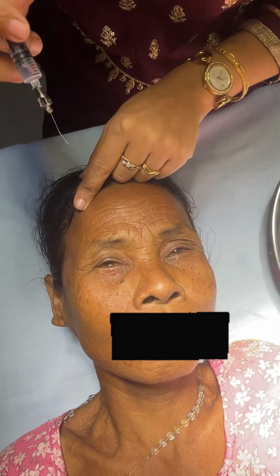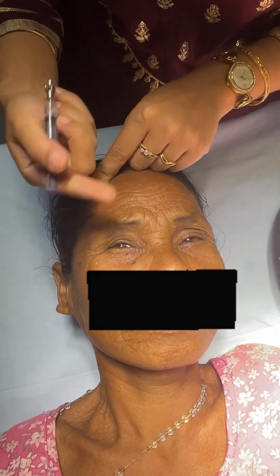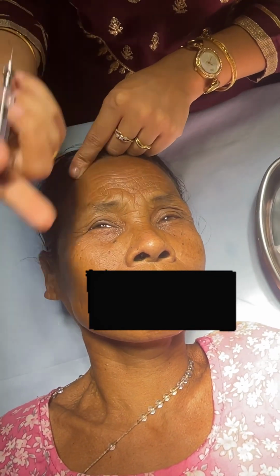So she says that it is going into her mouth. That gives us the result that nothing has come out. It has gone to her throat, to her mouth. She said, yes, I got it. So it is patent. There is no blockage, it is patent.